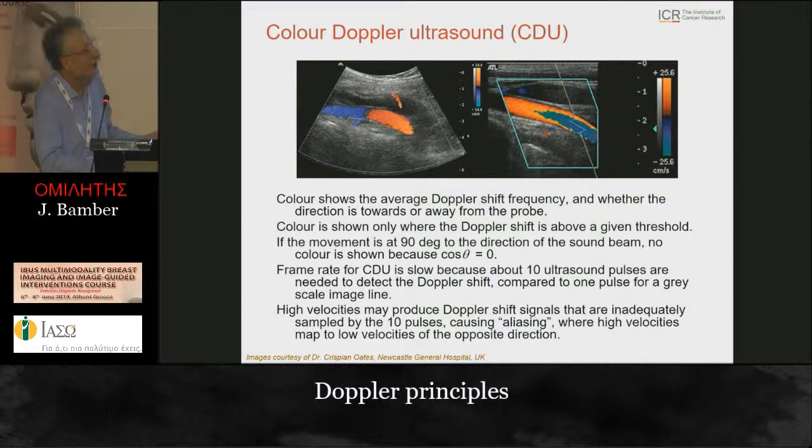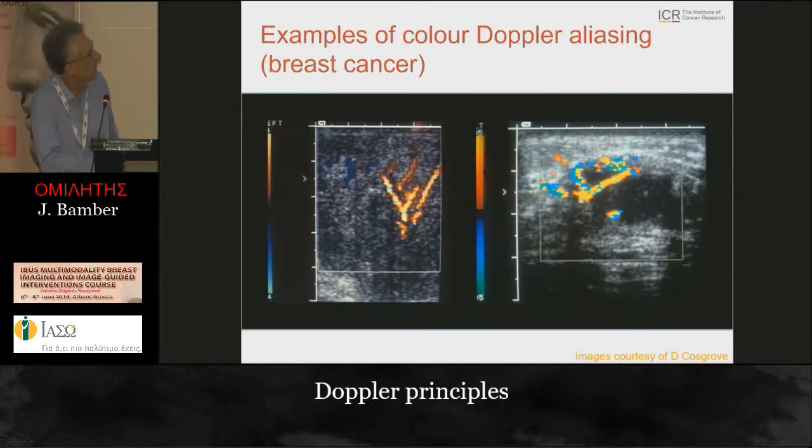So actually, though, for radiological applications, if you're only interested in how big the vessels are, which direction, what the pattern of the vasculature is, then possibly you don't mind that it's aliasing. Here are some examples of the patterns of vasculature in real breast tumours. These were actually taken with the very first colour Doppler system that Acuson made, a company that now doesn't exist, Siemens bought them.